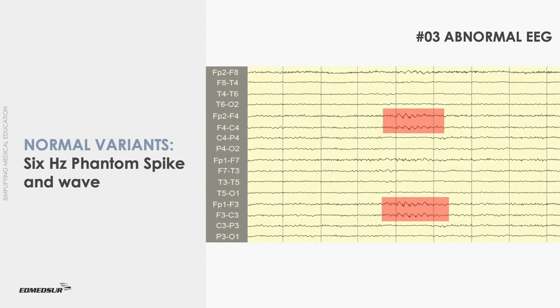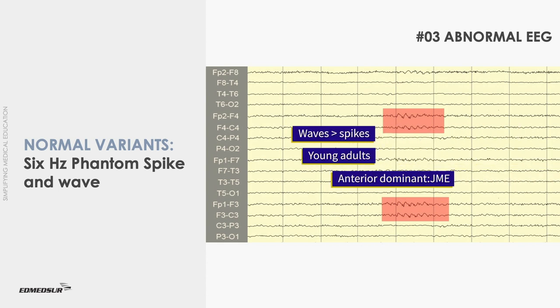6 Hz phantom spike and wave occurs as bursts of miniature spike and wave complexes at 6 Hz, rather than the usual 2 to 4 Hz. The term 'phantom' is used because of their transient or evanescent nature, as they usually last for less than 1 second. In these spike and wave complexes, the waves are of equal or higher amplitude than the preceding spikes. Spikes are usually less than 40 microvolts in amplitude and 40 milliseconds in duration.